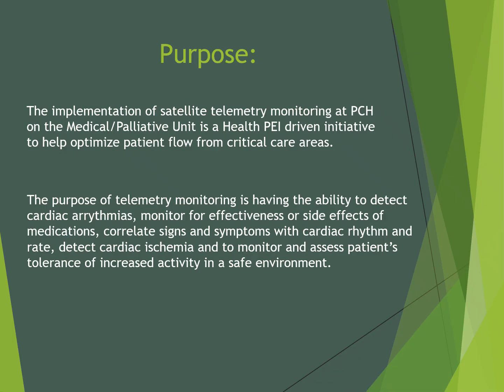The purpose of telemetry monitoring is having the ability to detect cardiac arrhythmias, monitor for effectiveness or side effects of medications, correlate signs and symptoms with cardiac rhythm and rate, detect cardiac ischemia, and to monitor and assess patients' tolerance of increased activity in a safe environment.